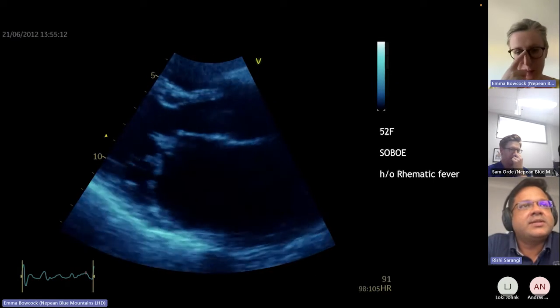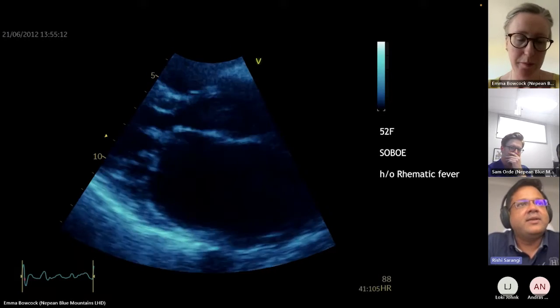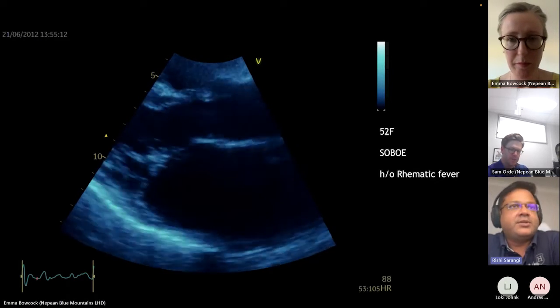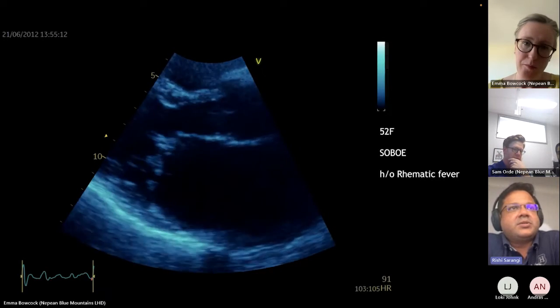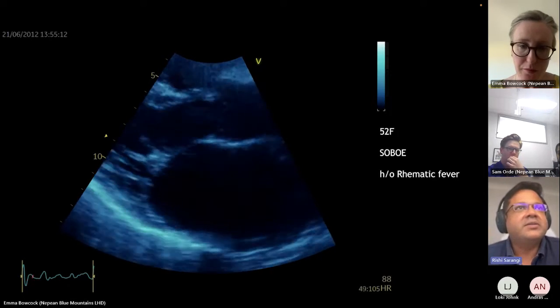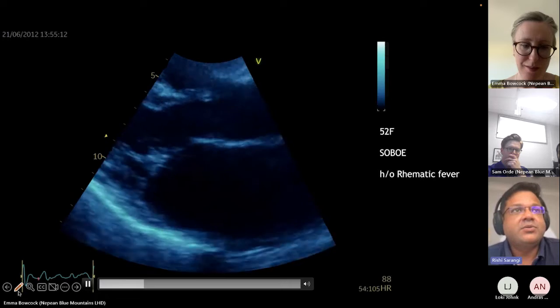Yeah. Parasternal long axis view, which shows a zoom view of the mitral valve, showing again thickening at the tips with a hugely dilated left atrium. LV contractility appears normal. Can't see much of the aortic valve. RV outflow tract is partially cut off. The anterior doming of the anterior mitral valve is also apparent.